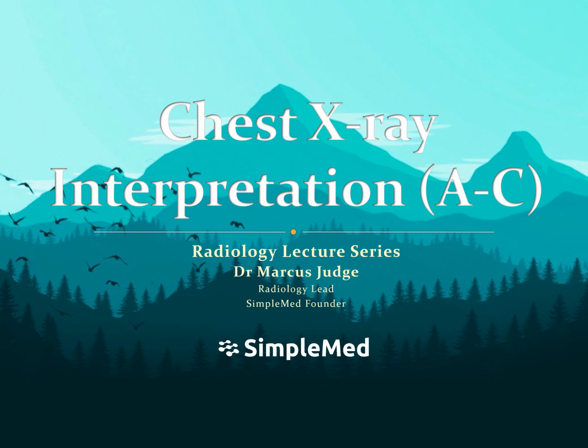Today will be a lecture on the interpretation of chest x-rays. This lecture is aimed at preclinical or phase 1 medical students and allied health professionals, and so it is pitched at that level.